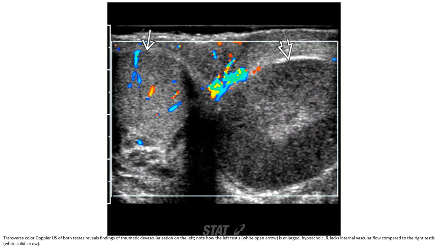Color Doppler ultrasound of both testes reveals traumatic devascularization on the left. Note how the left testis is large, hypoechoic, and lacks internal vascular flow compared to the right testis.